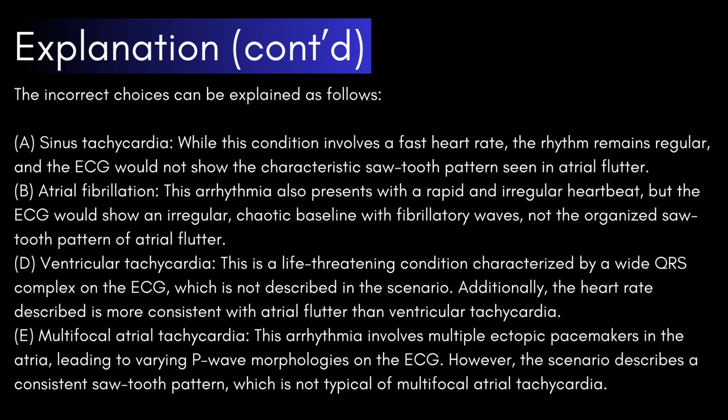E. Multifocal atrial tachycardia. This arrhythmia involves multiple ectopic pacemakers in the atria, leading to varying P-wave morphologies on the ECG. However, the scenario describes a consistent sawtooth pattern, which is not typical of multifocal atrial tachycardia.